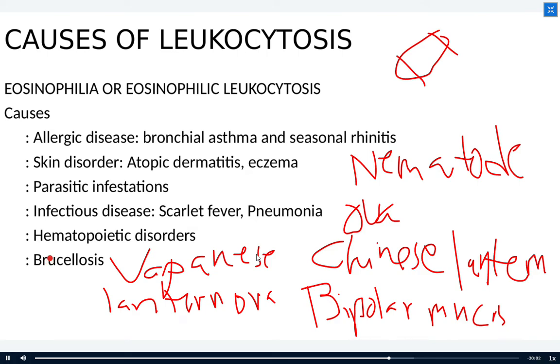Related sa Pilipinas yan, class. Yung Japanese lantern ova na. No, it's not your Japonicum. Okay. No. Related sa Pilipinas. Your strongyloides does not have an ova, and not commonly seen your strongyloides. It's not your enterobius, Japanese lantern. Alright, it's your capillaria philippinensis. Very good. So your capillaria philippinensis.